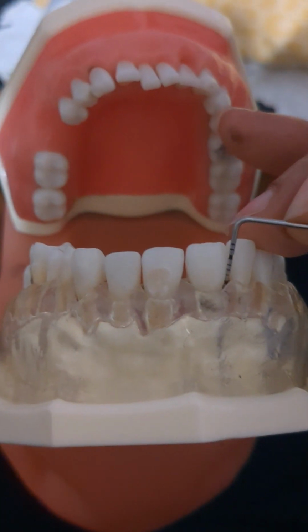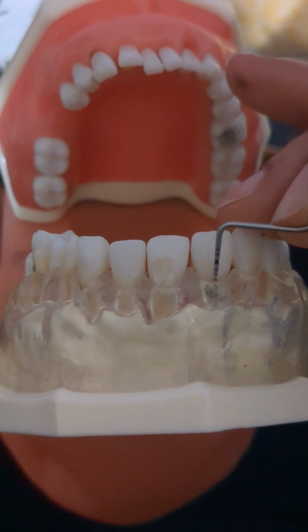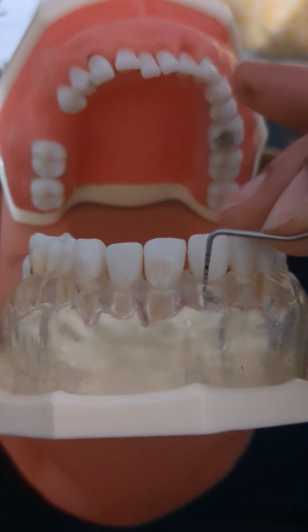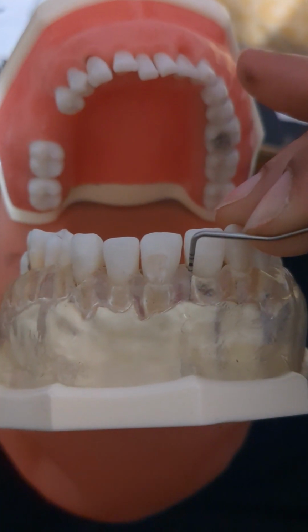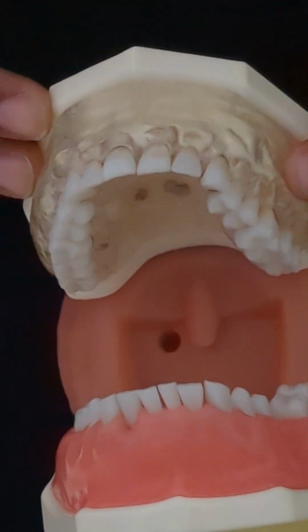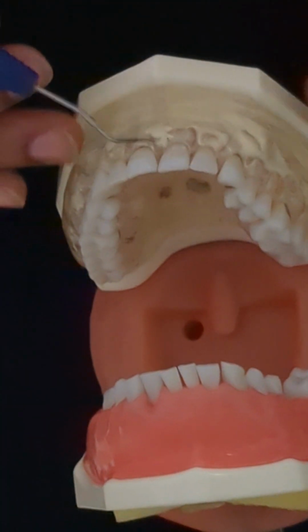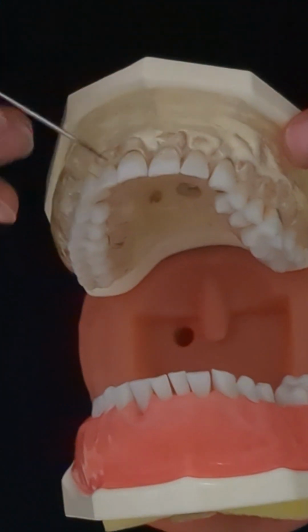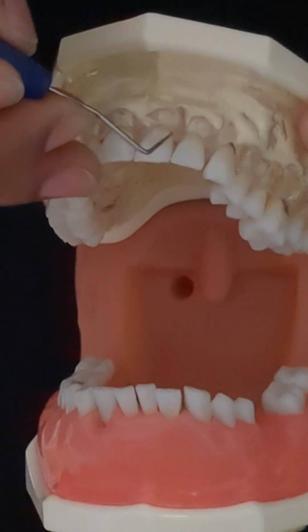Have a 7, walk it back up, keep your head straight. We're going with 6, rotate. This one again is an 8. Okay, so now we're entering the second quadrant. So our distal line angle will be on this side. Okay, let us begin.